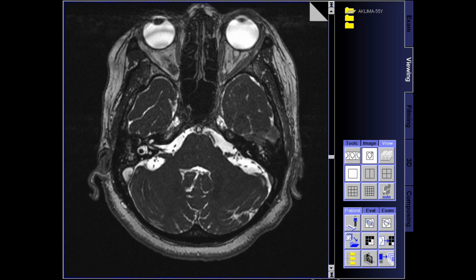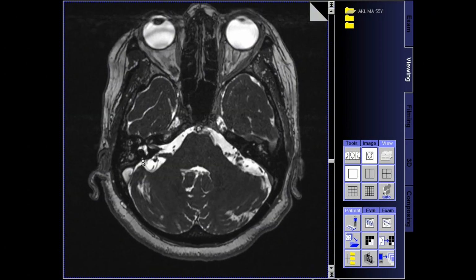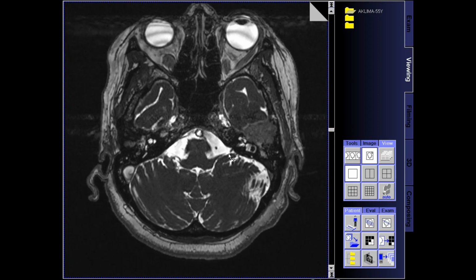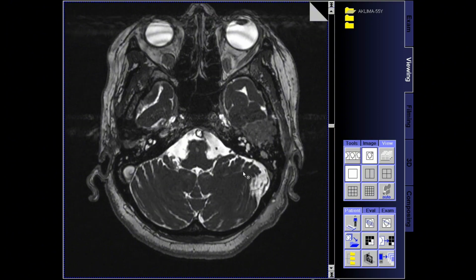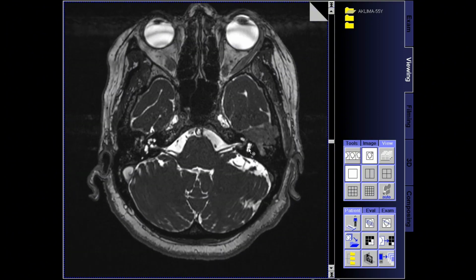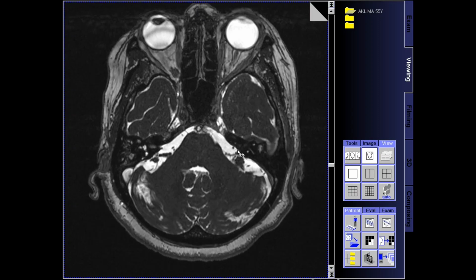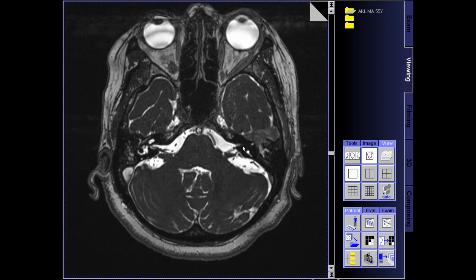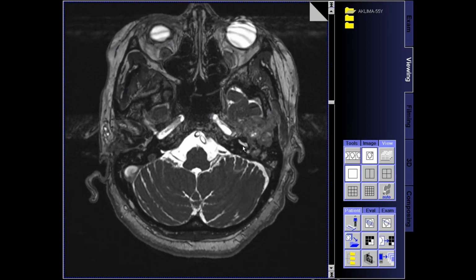canals, and cerebellopontine angle. MRI of the IAC is highly sensitive for identifying small tumors, demyelinating changes, infections, or structural abnormalities. Therefore, in cases of unexplained vertigo, recurrent tinnitus, facial nerve symptoms, or sudden hearing loss, MRI of the IAC is a crucial diagnostic tool.